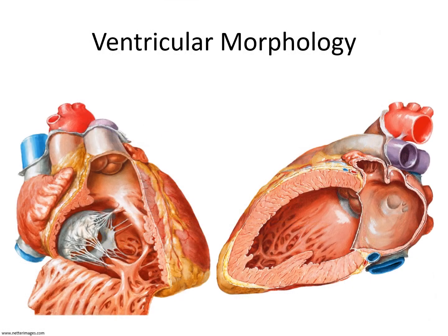Now, the most fundamental part of performing fetal echo to identify congenital heart disease and abnormalities within the fetal heart is morphologic assessment of structures, or understanding the normal structure and identifying what is abnormal in the way that things look in terms of their features within the cardiac structure. And in this case, we're showing both ventricles, the right ventricle here on the left and the left ventricle here on the right, and we can see that there are stark differences between the two.